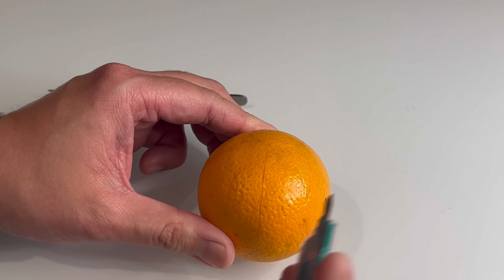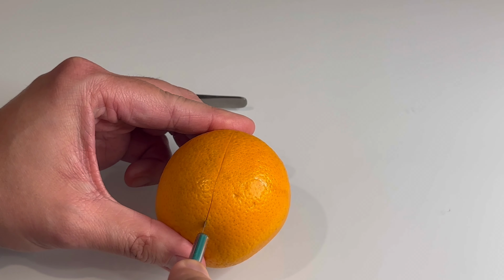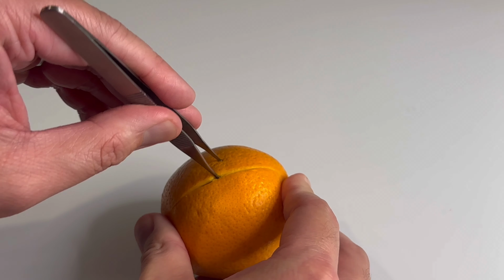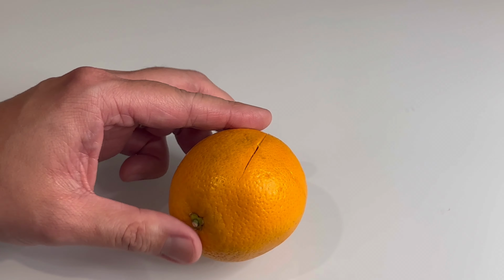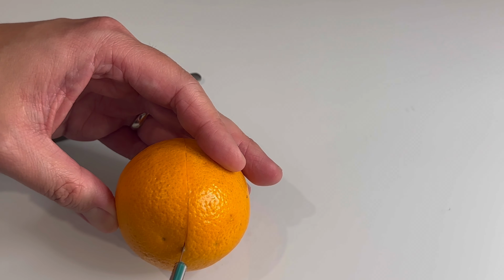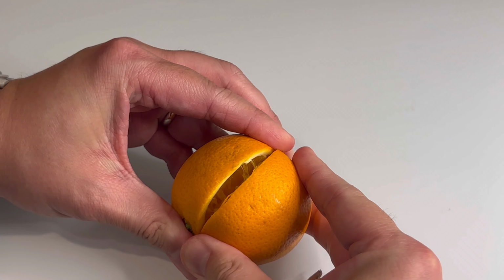And one important aspect when you're cutting something is you want to cut it long enough so that you're able to retract it. And so if I've cut it this long, and notice if I'm trying to peel the skin, it doesn't provide enough retraction. And so by cutting it longer, extending your incision, you'll be able to get a better exposure and visualization. And so now I'm going to retract better. And so you could see inside the orange.